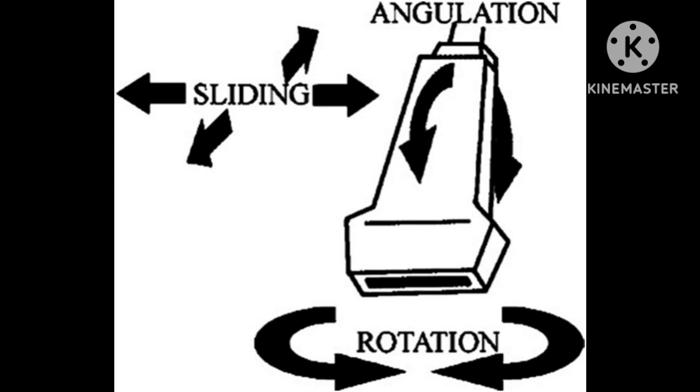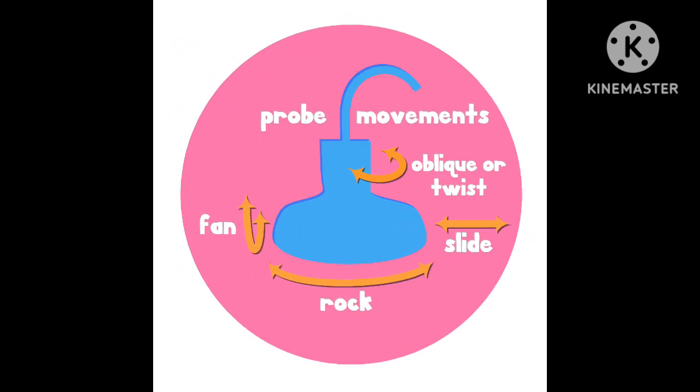section of the image. If you are starting with transverse section of an image, just clockwise movement of the probe, you can take longitudinal image of an organ. That means rotation movement of the probe is used when we want to view a targeted structure in different plane. At last, there are 5 probe movements: sliding, fanning, tilting, rotating, angling, and at last combining movement.